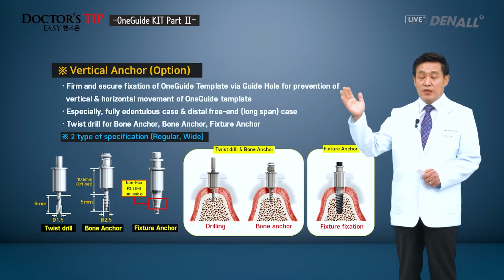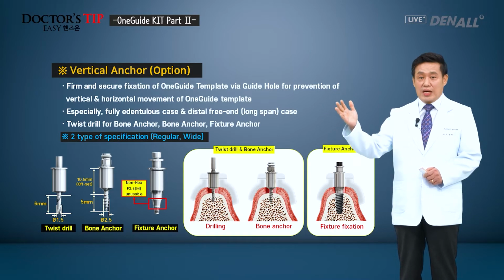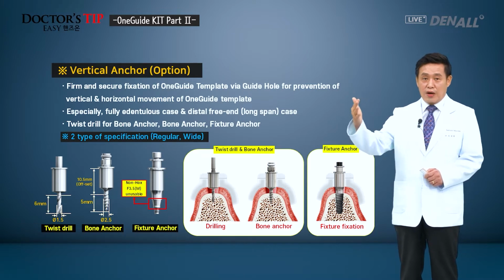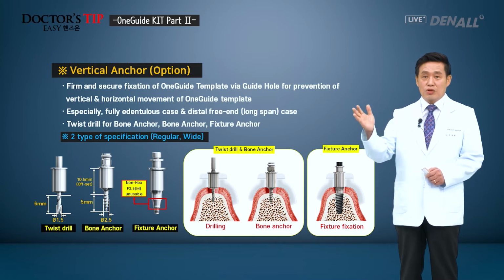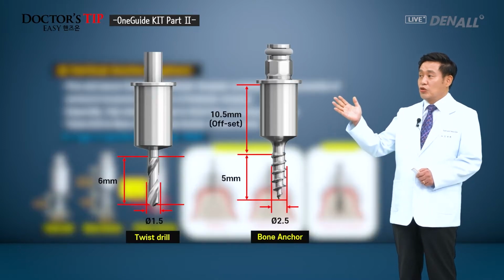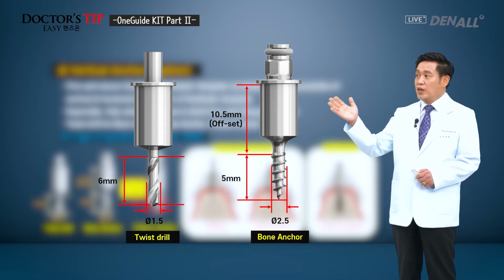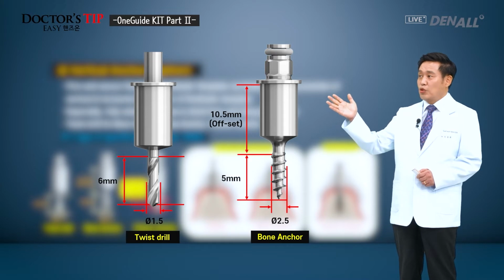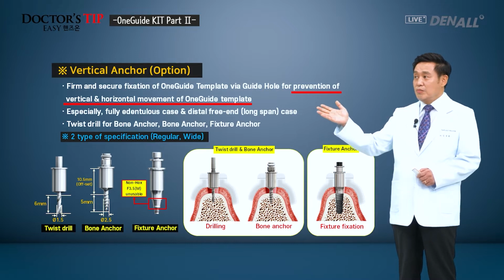Another option is vertical anchor system. Lateral anchor system mentioned earlier. At times, depending on palatal or gingival thickness, template deviation can occur. So, virtually planned fixture position can be deviated. And in order to prevent this, vertical twisted drill and bone anchor is used. Easily put, using OneGuide template guide hole, you can prevent vertical and horizontal movement. Vertical anchor system is used for this.